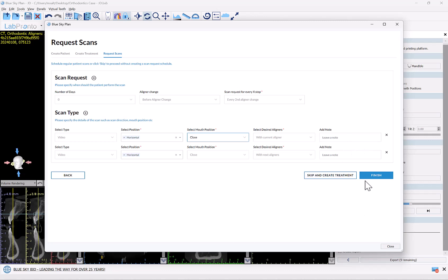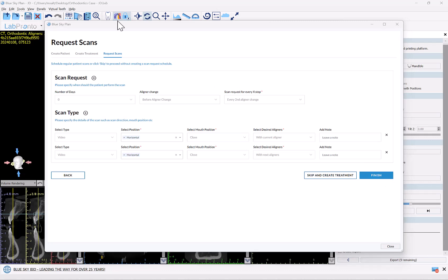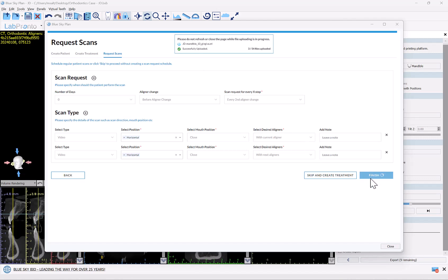Once you've confirmed the three steps, simply click Finish. We have the option to skip and create treatment — if you don't want to create a schedule and just want to press a button every time you want to scan you could do so, but we highly recommend using the schedule, which will prompt the patient properly. After clicking Finish, the software uploads the relevant STL files directly from Blue Sky Plan to the Blue Sky Monitoring platform. You can see the indication on top of the screen that the files are being uploaded — keep the window open until you receive the notification that all data has been uploaded successfully.